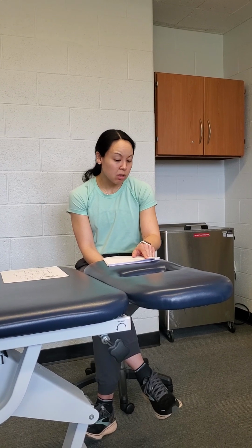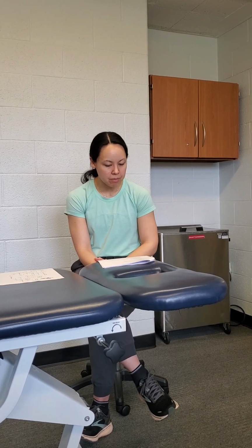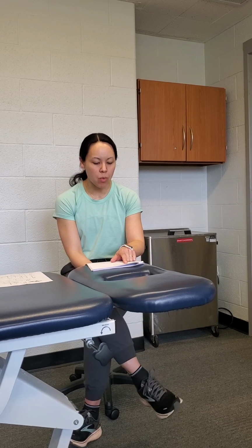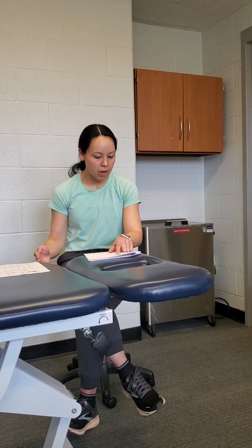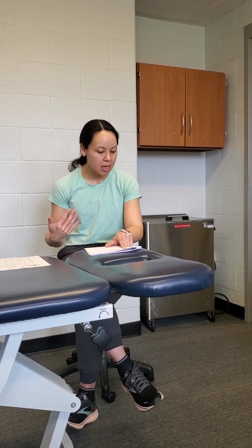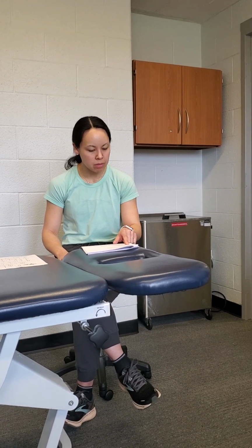They can do intervals on the bike or a steady state. Kind of depends on what they can tolerate and what you're going for. If you're doing intervals, then you would want to do 5-minute intervals, then deflate the cuff and repeat that for about 3 bouts. If you're doing steady state, just leave the cuff inflated the whole time.